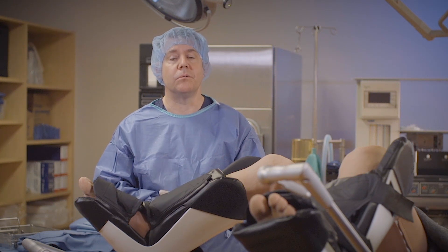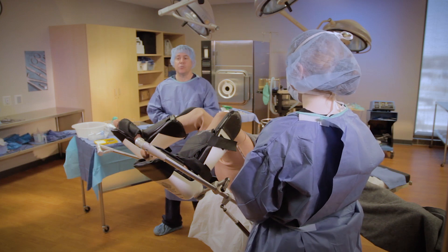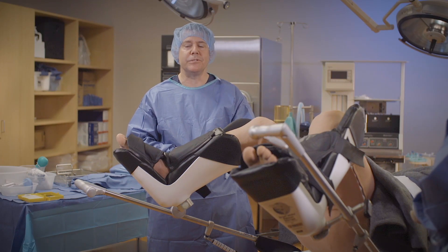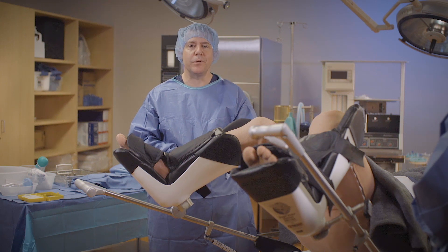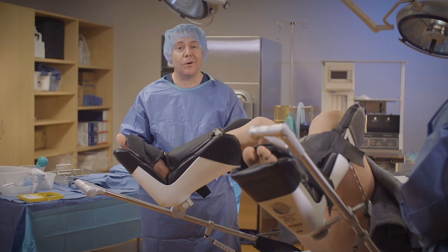So here we go. The surgeon has walked into the room. We have gowned and gloved them and we are ready to drape. I have my good friend Charlie the mannequin up in lithotomy position — I love him for doing that so it means I don't have to be up in lithotomy position.